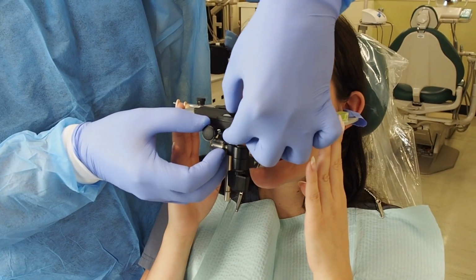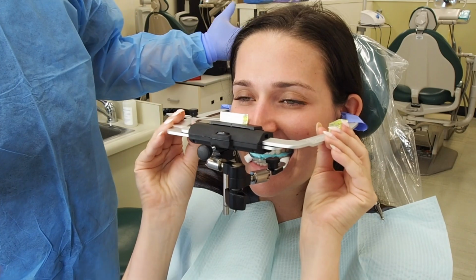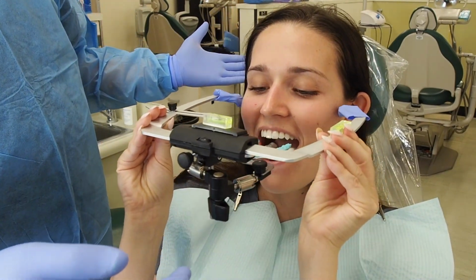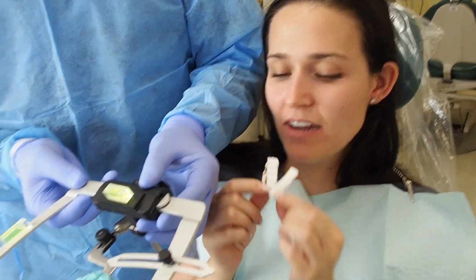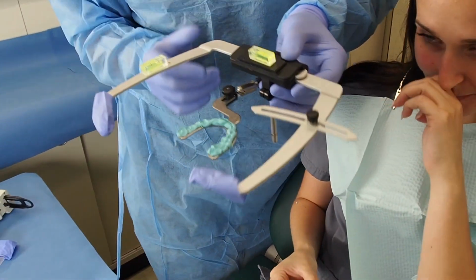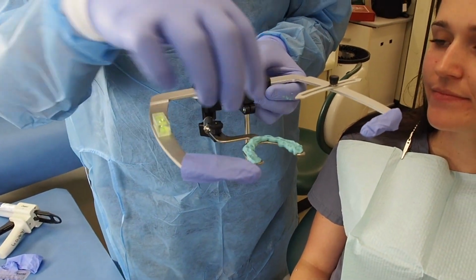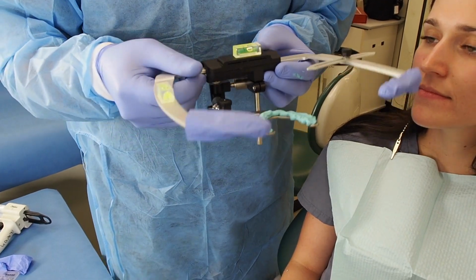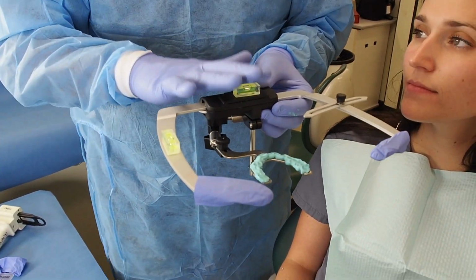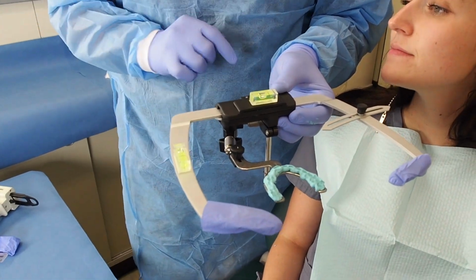Then I will just untie this and I'll ask my patient to take the whole complex system out of it. And this is what I get. If you see it from here, I get the position of the maxillary with the axis right there. Now I will transfer this onto the articulator, and this is how we do it.